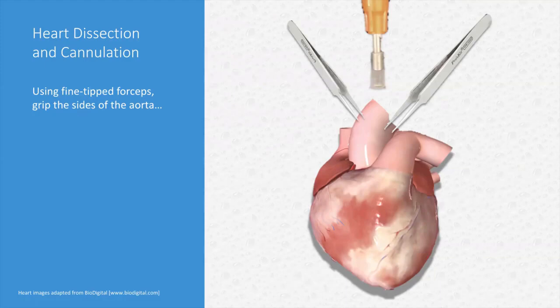One should always follow institutional animal care and use committee approved methods to sacrifice the animal and to remove the heart while it is beating. It is very important that the animal is fully anesthetized and remains non-responsive to the pinch before you open the chest and remove the heart.